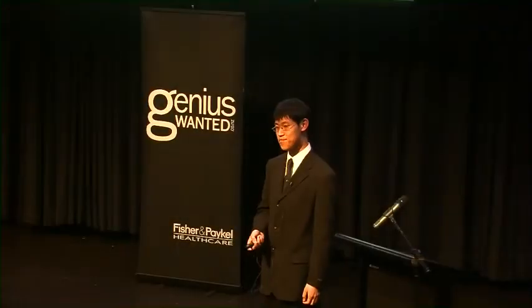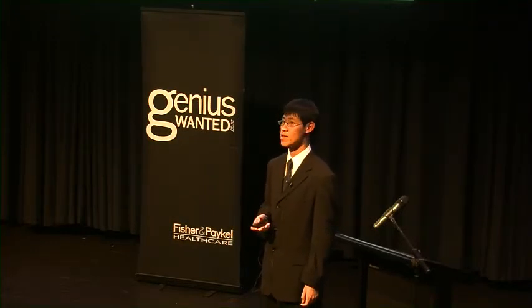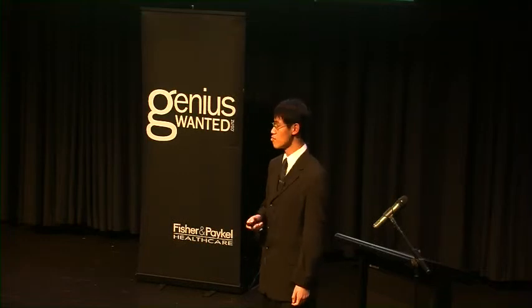After about 40 hours of scanning and processing using some software that I've written, I was able to produce this animation, which shows the background phase as a result of a single step change in the scanner's magnetic field at one slice orientation, and how it changes in the spatial and time dimensions. The more interesting features of this animation is its variation in the time dimension. So for example, if we take this point here and plot its value in the time dimension, we get this graph, which shows that background phase actually decays with time.